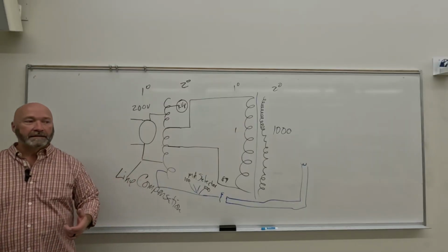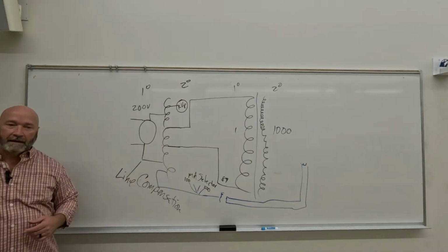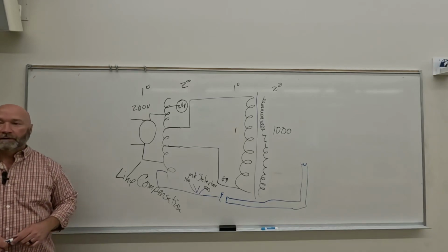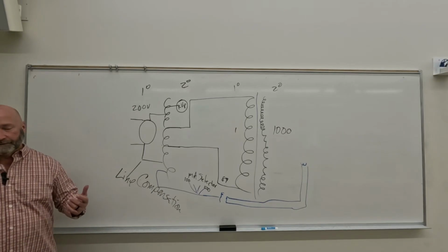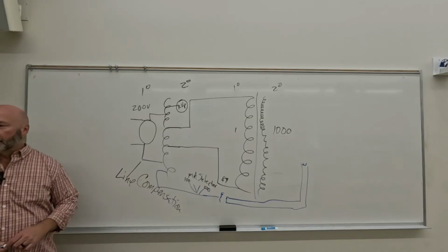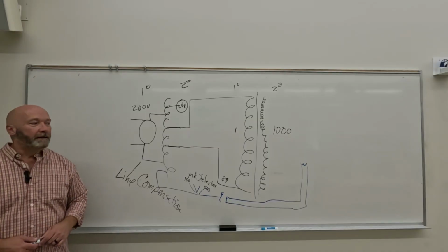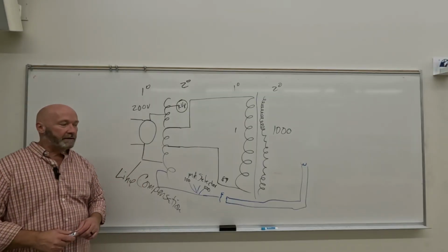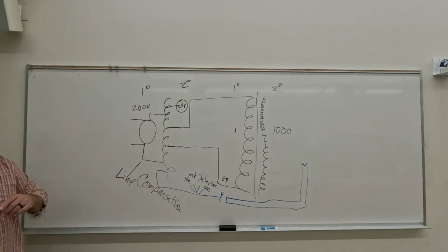Yes. Yeah, breathing techniques. We're going to see the sternum, spine. There's a C-spine view that we can do as well. It's called the Ottonello method, if you just wake up in the middle of the night and want to get bored with something. So the Ottonello method is a movement of the jaw so that you can see the upper C-spine. And we'll talk about that later in the semester in positioning.